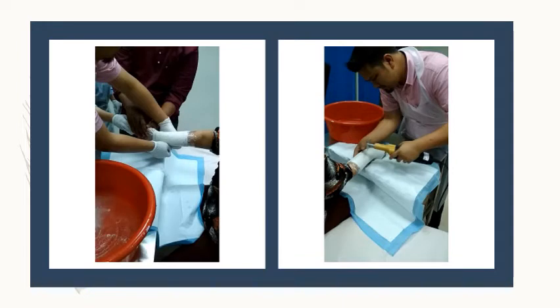This is an example of a conventional method to attain patient's anatomical shape, size, and features utilizing plaster of Paris, or for short POP. This process consumes time, appears messy, and utilizes a lot of consumables, hence will incur more cost.